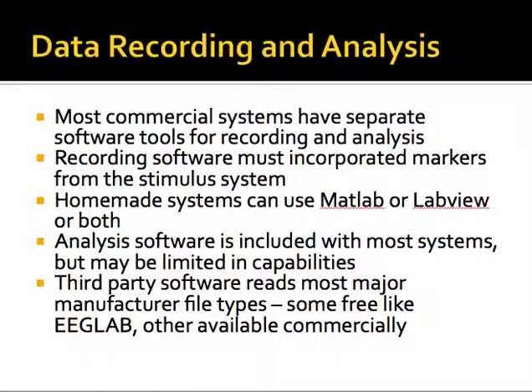A couple of important things. Usually, if you want your recording software to incorporate markers that are coming in from your stimulus system, and by this we mean time markers, you have to set that. It's a setting in the software, and it's very, very important that you do that. If you don't know when your stimulus was presented, there's no way you can analyze the response and know that the response was consistent with when the stimulus was presented. So it's very important to know that. It's very important to have a common t=0 starting point. And so usually the software does that, but it often doesn't do it automatically.